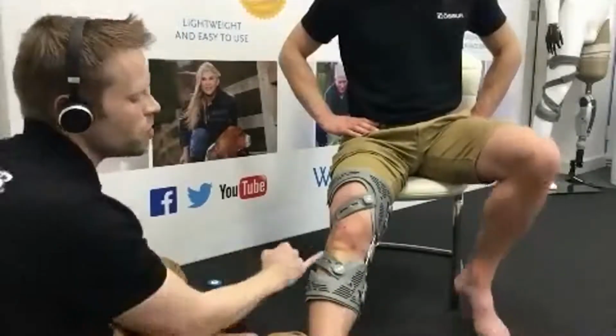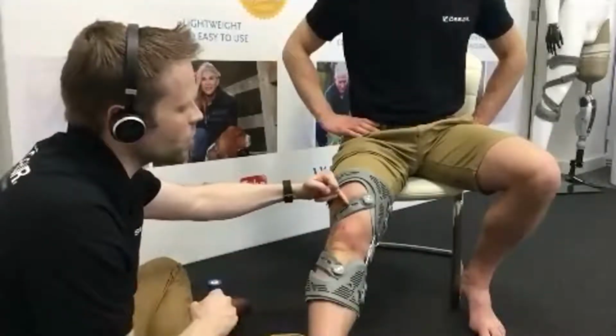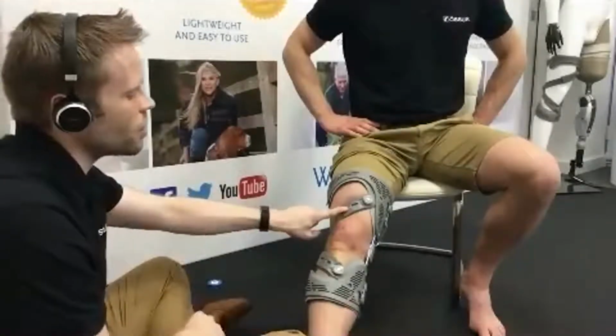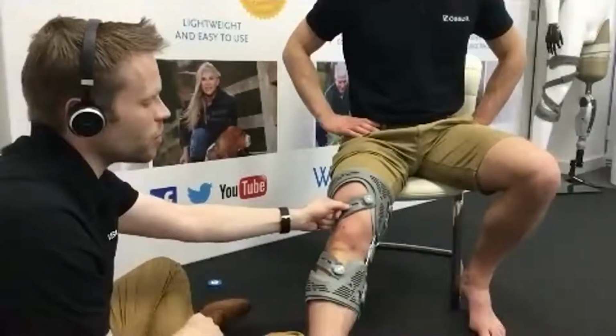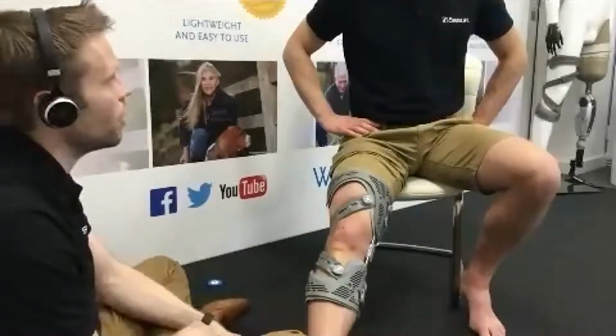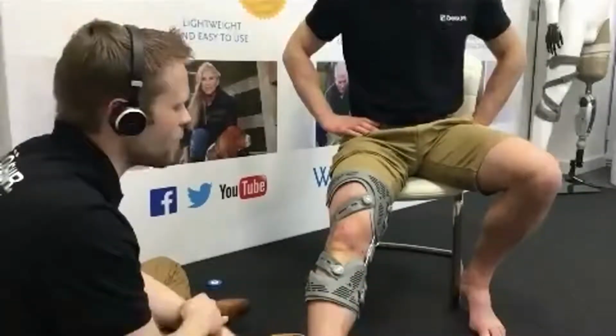And because we're using these smart dosing sections just to get it in the correct position, you can make adjustments to it. So I know, because I've got this one at 6, that I need to tighten that strap by that corresponding amount, so about 3 to 4 mil, before I finish the fitting at the end. Okay, so we've got a nice good fit here. If we can get Pete to have a stand.